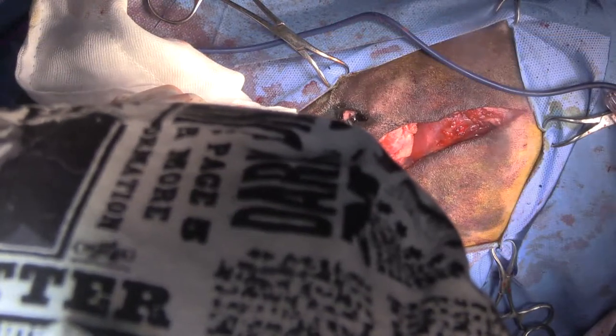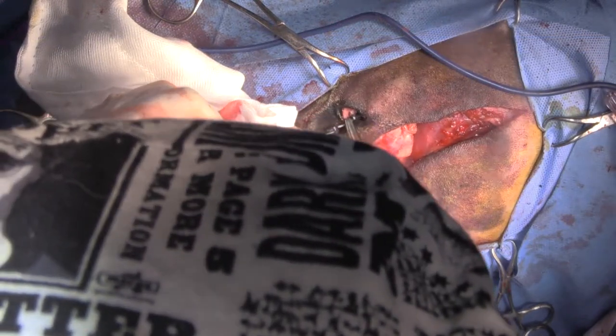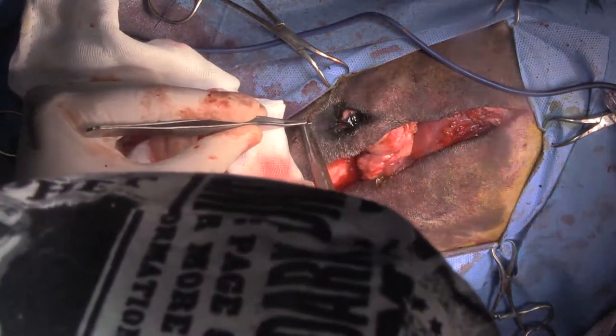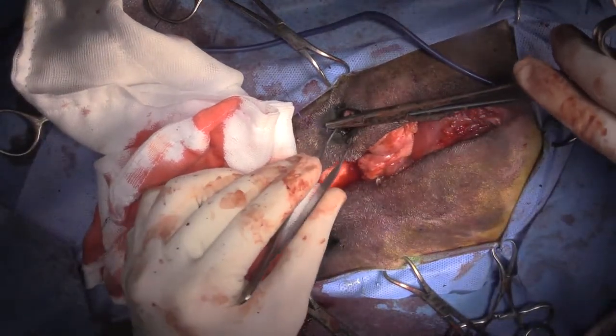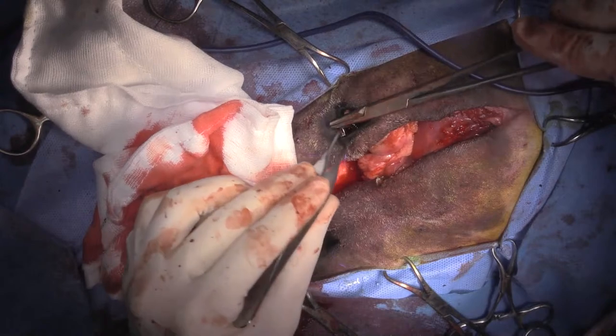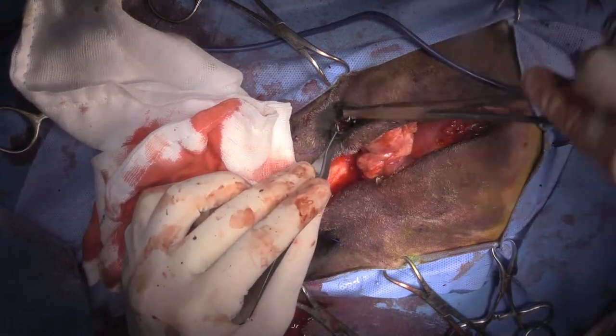Jeff suturing. So we're just closing where the medial canthus was attached to the skull. We had to remove that area, and so it just created a little hole where the nasolacrimal ducts originate.